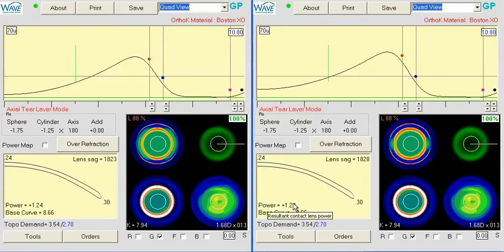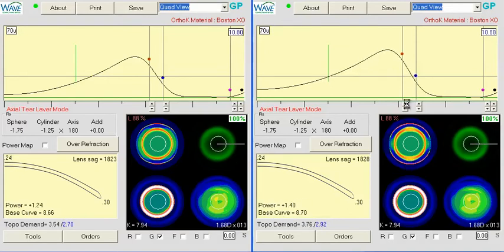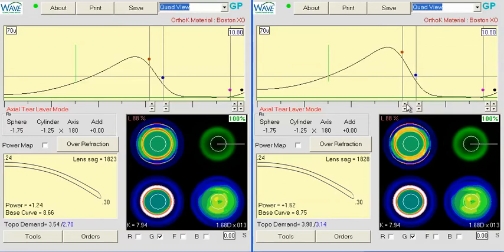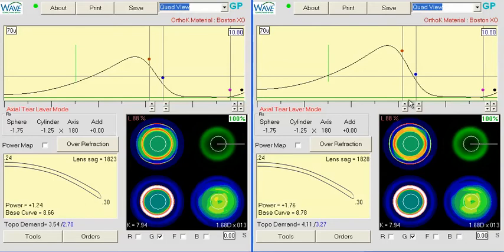So I would probably bump this power about a half diopter or so, and just click up until we're close to 1.74, and that's probably the closest we'll get there.